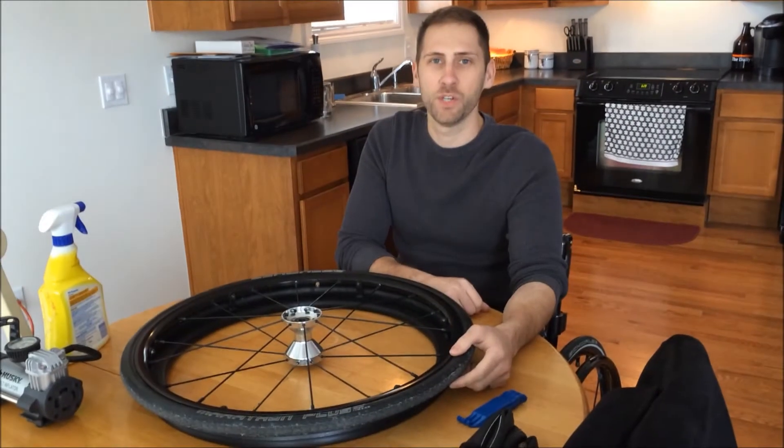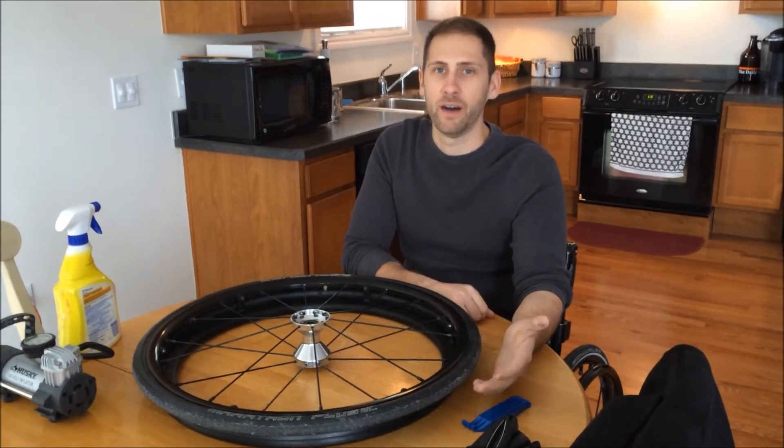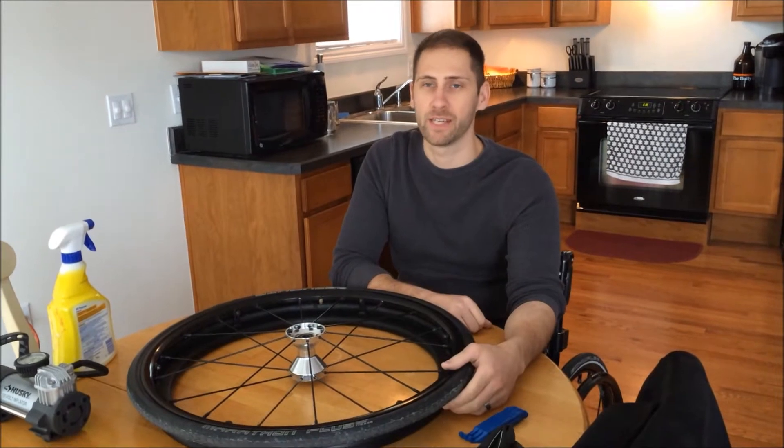Today I wanted to do a quick video just showing how to repair a flat tire on your wheelchair. Odds are, if you're a wheelchair user, eventually you're going to have a flat tire.